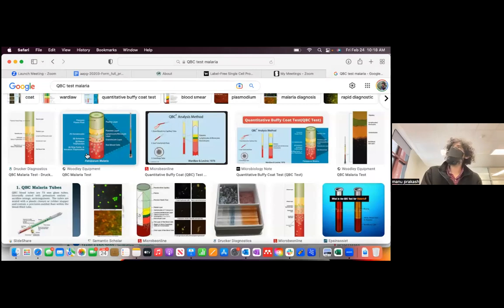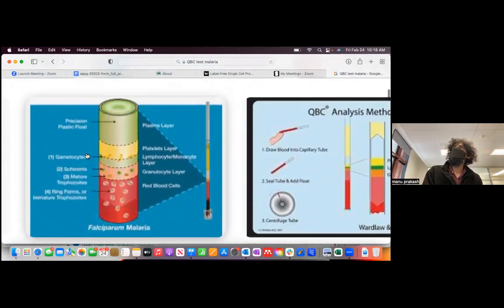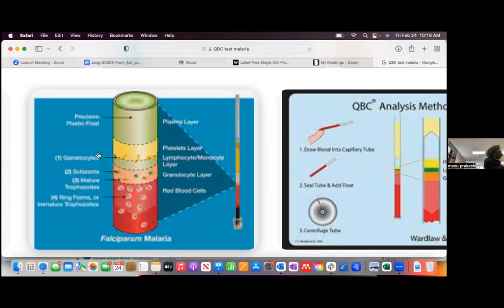If you look at this picture right here, if we take a drop of blood, which we'll try doing today, do you know where we left the capillaries? In one of these boxes? Oh, right here. You can take out a person's blood in a single drop in a capillary, right? We did that last time when we were making smears.